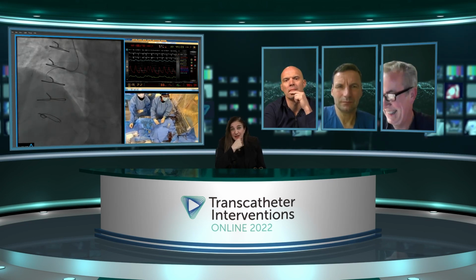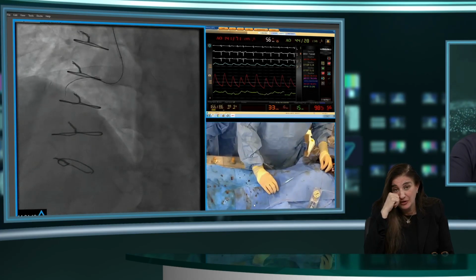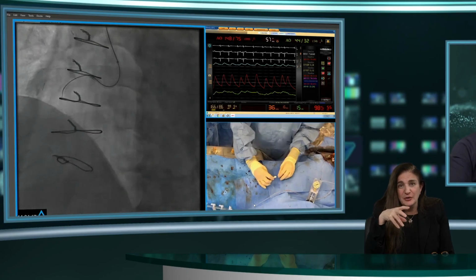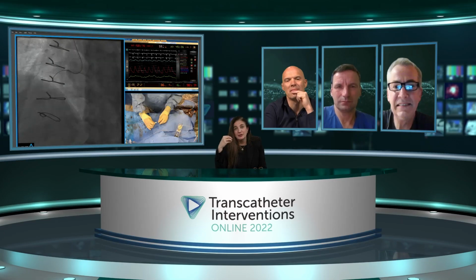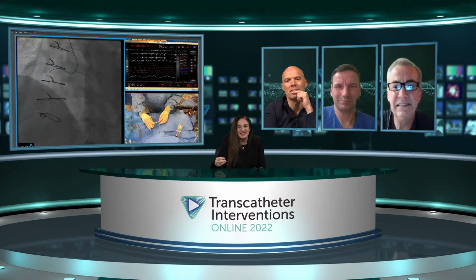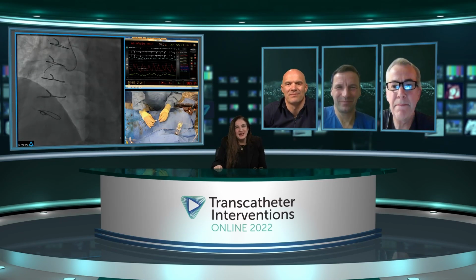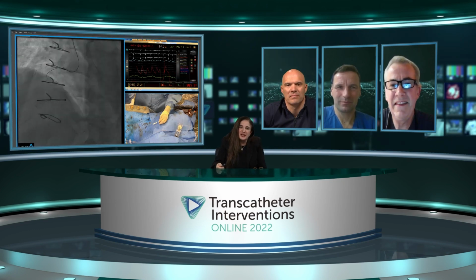Because it just looked from the diagnostic approach that it would be really, really difficult and very ambiguous. And now with good angiography, I think you have a great case and a great example of Margaret's lecture. So I just think it's going to be great for us to kind of see it in action. Any comments, Holger? What do you think? Do you agree now? And David, you said, oh, this is going to be a retrograde approach, but you see, with better imaging now, we can go antegrade, and I fully agree.